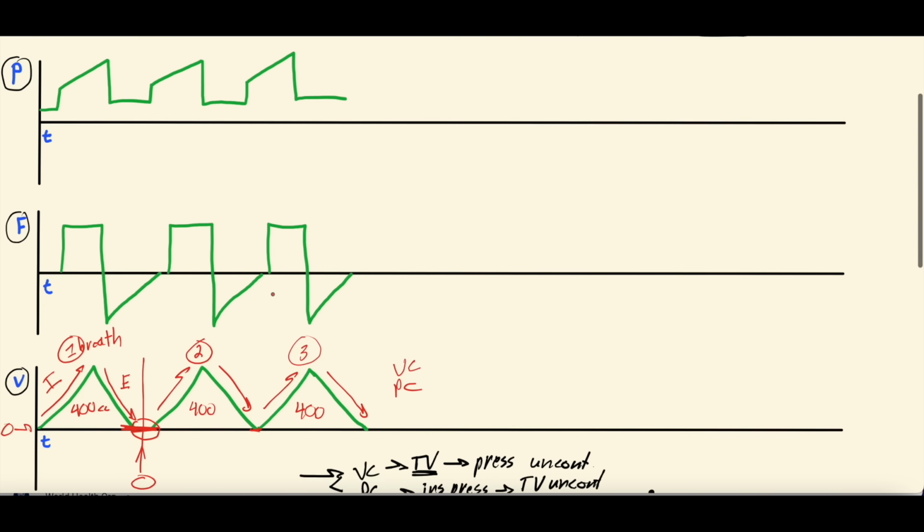What about these other 2 scalars, though? You have flow and pressure. So as we said, when the ventilator delivers a certain volume, the ventilator is going to experience a pressure, right? Because if you push air into the lungs, there's going to be a pressure that develops that the ventilator senses while it's pushing that air in, all right? And that's going to vary, depend on the cycle of the breath. But something to know about volume control is even though you're setting a tidal volume, the ventilator is actually targeting a flow. And this is going to make sense in a second.